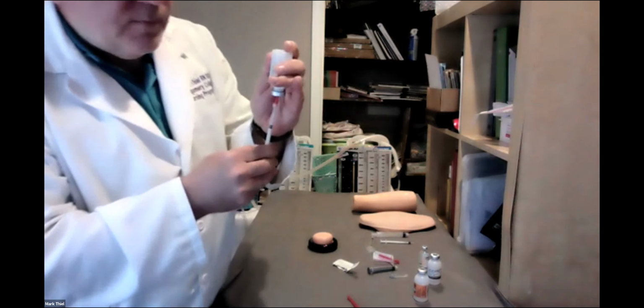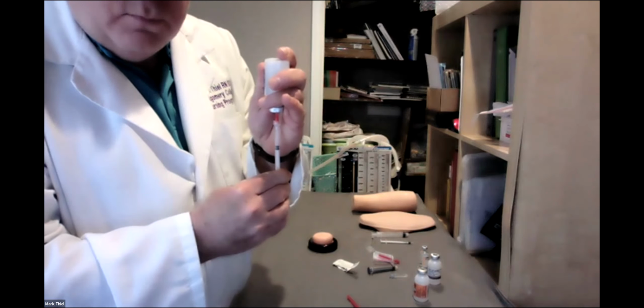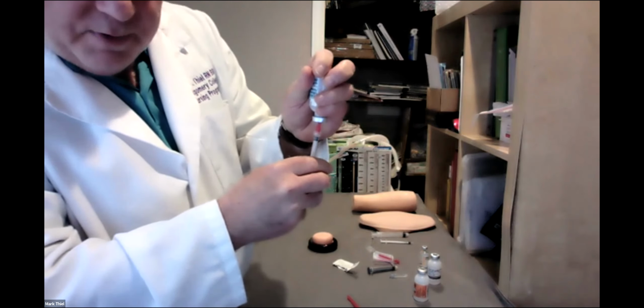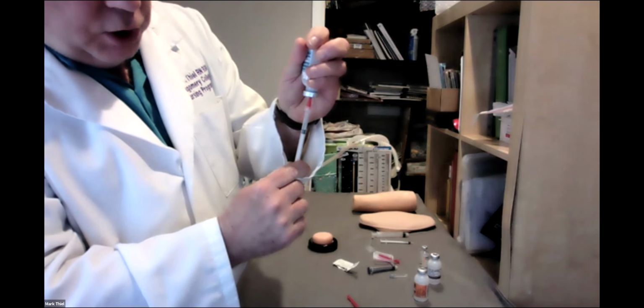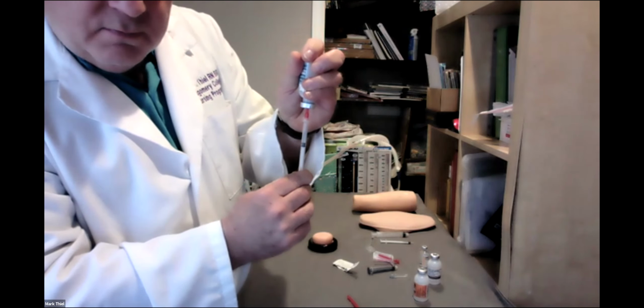Ready? Now, it doesn't work. Real world nursing, it won't work all the time. Technique two: pump it back up, redraw to your dosage slowly. This may relieve the bubble.